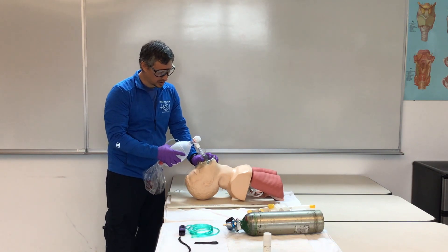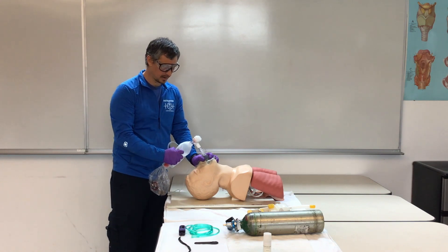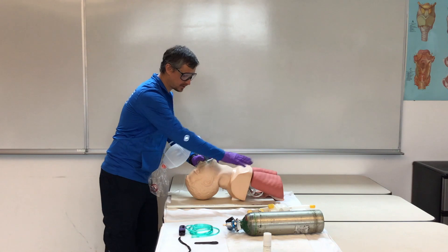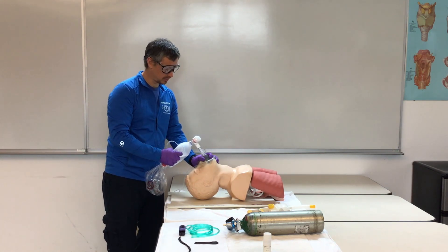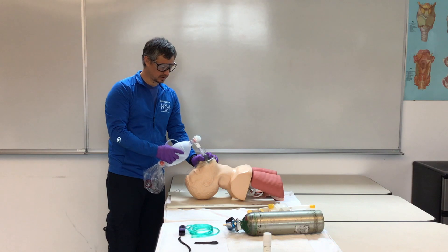When we squeeze our bag for ventilation, it's just a nice easy squeeze. There's no need to squeeze fast and rapid — that causes more air into the epigastrum or stomach — and we don't want to squeeze too slow either. Just a nice easy breath. We're going to count to ourselves six seconds: one, two, three, four, five, six — then squeeze.